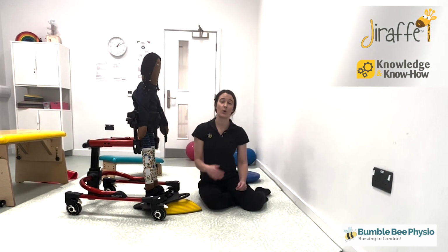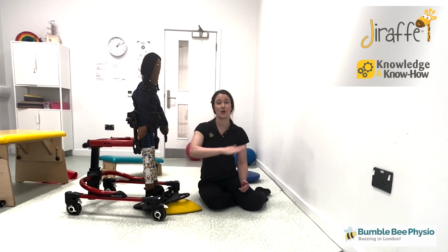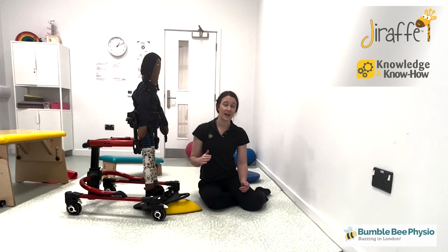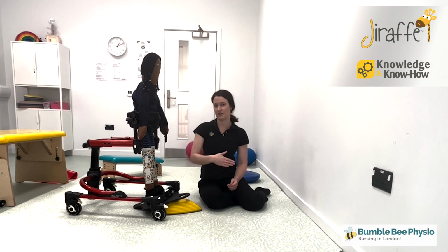Now this is all going to be weight shifting onto each leg. You can even use one of those wobbly wedges underneath it as well, which are filled with air, if your child is able to get their foot up into dorsiflexion. If they're not, and if they're actually stuck in plantar flexion, maybe even plantar flexion is a stretch, you could use that wedge the other way around, so their toes are going down into plantar flexion.